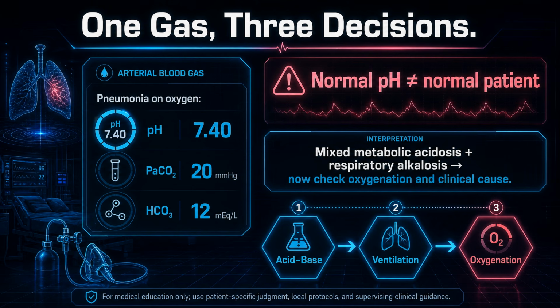That is the mindset for this lecture. Do not stop at the pH. Use the whole gas, use the chemistry panel, and always return to the patient.